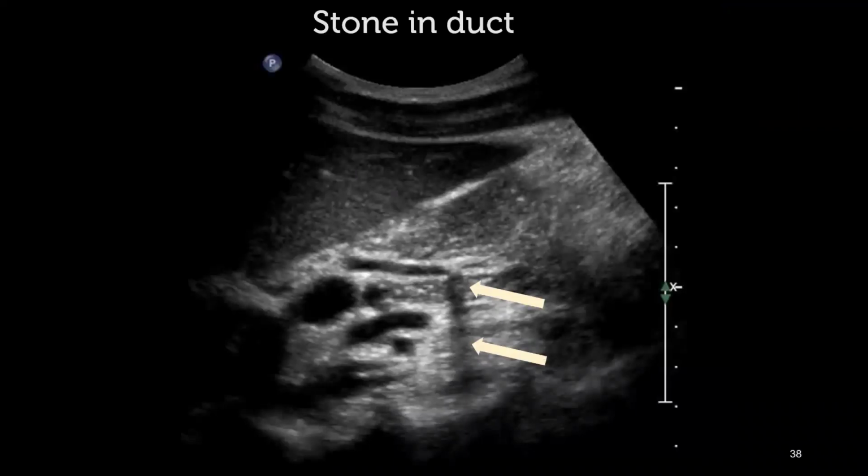No, it's mainly always in longitudinal, and the more advanced measurement is sometimes the transverse at the level of the head of pancreas, but you only ever see that view in 5 or 10% of patients anyway, so I don't think it's really a POCUS application. I think it's a sonographer application, so I would stick to the longitudinal.